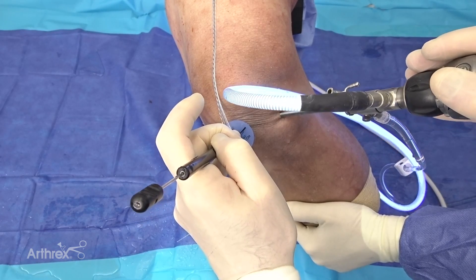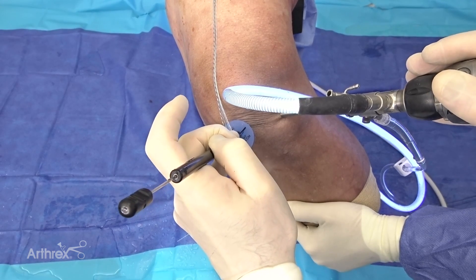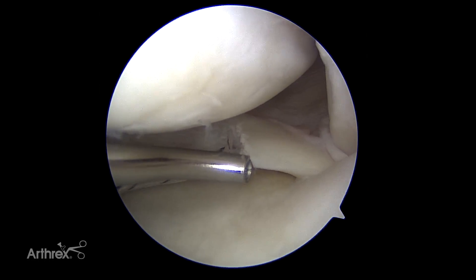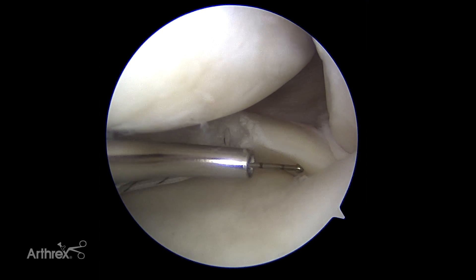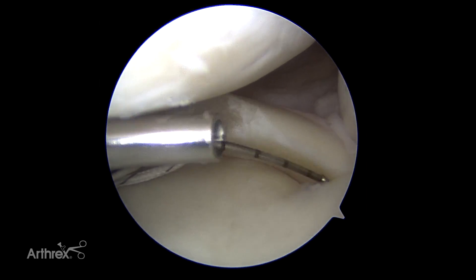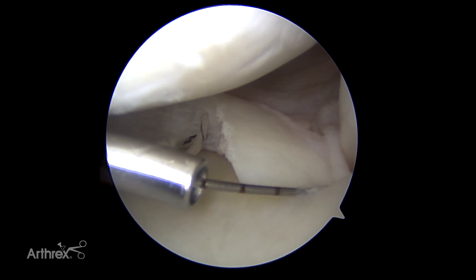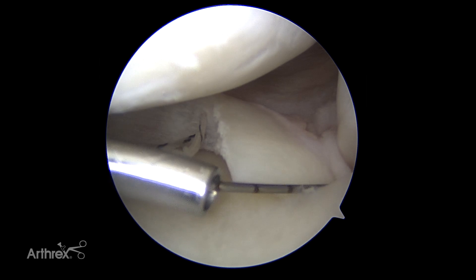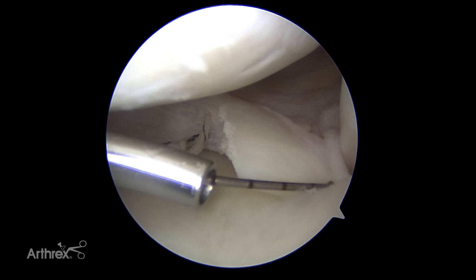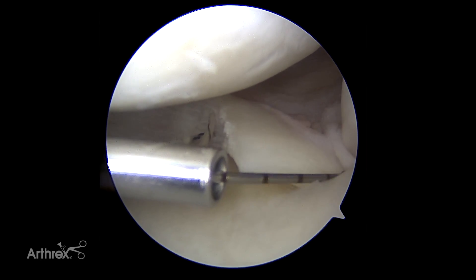Before we go and create the exact match for the segmental meniscal graft, the last measurement I want to do is how far I am from the posterior defect to the root, so when I go to the specimen I can match that up. From the root attachment it's about six to seven millimeters. That will allow me when I cut the specimen to leave seven millimeters from the root and then cut 25 millimeters to the front — just a helpful reference point.